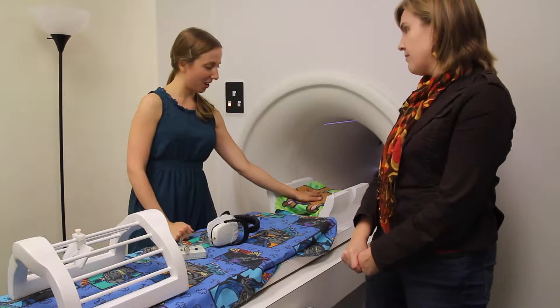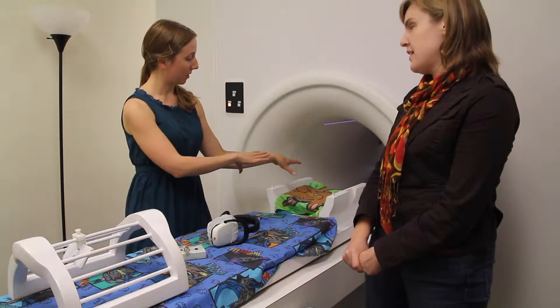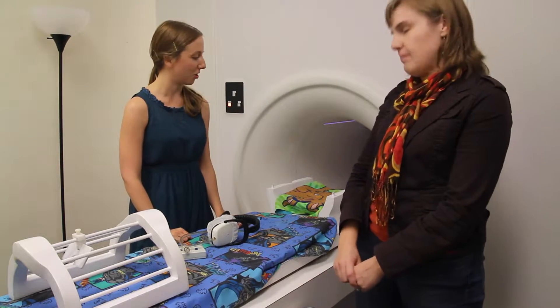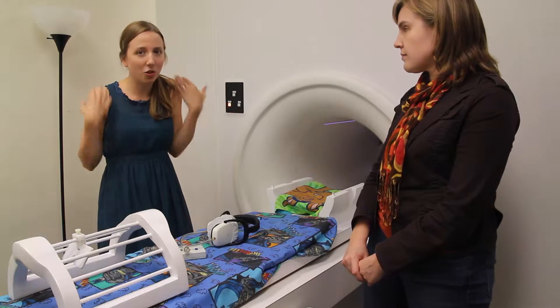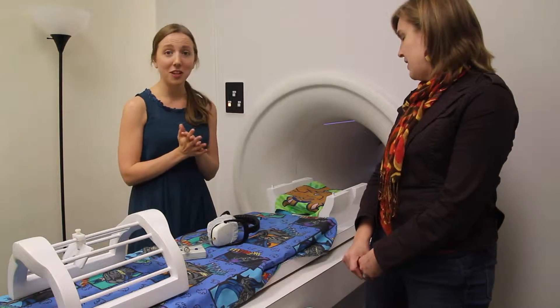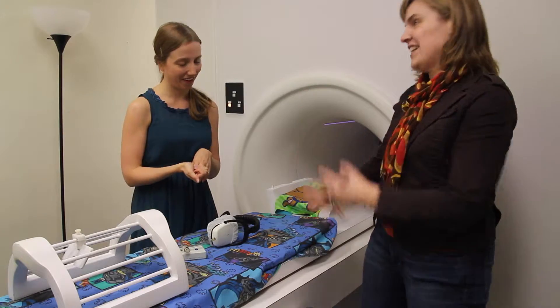Your head is going to go right here with your nose up, and we're going to slide the bed into the tunnel, because the way the machine works is we can take pictures of whatever is in the middle of the tunnel. So you're going to be lying in there with your head, shoulders, waist — up to about your knees or so in the tunnel. When you're inside the MRI scanner, we don't want you to get bored. You actually get to do things — you get to watch videos or play special computer games.